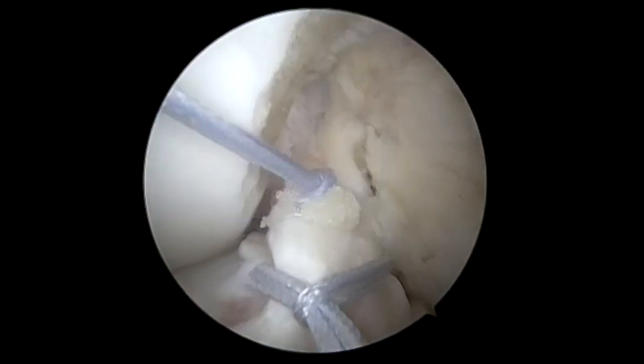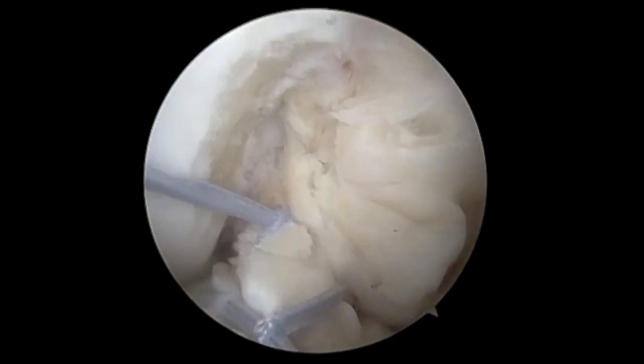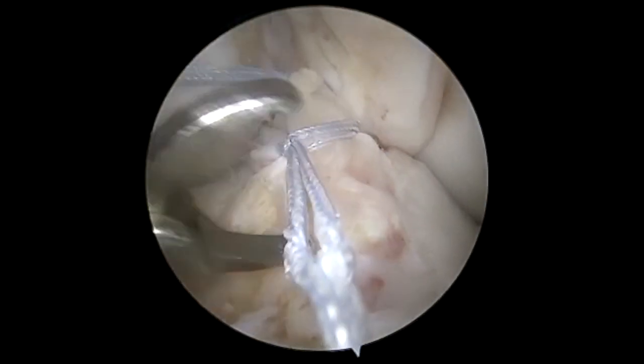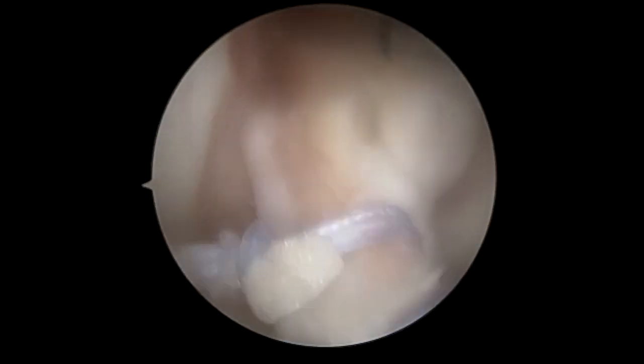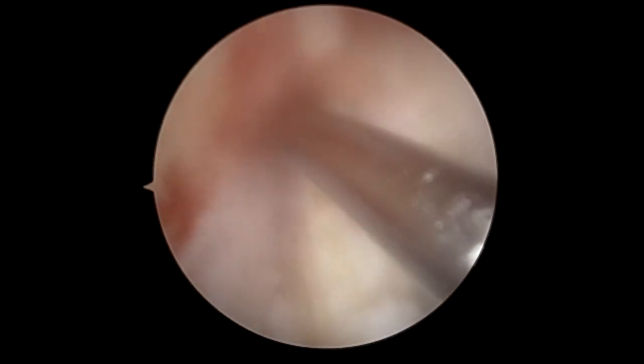You can see we have good tissue quality. We've done the sutures first because we wanted to confirm the quality was good enough to do this technique.